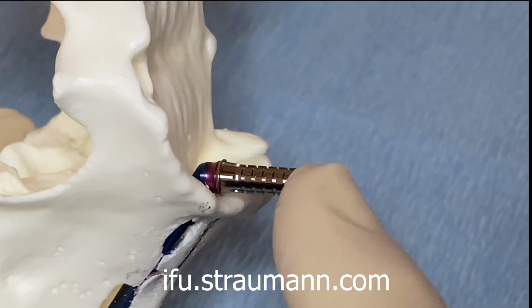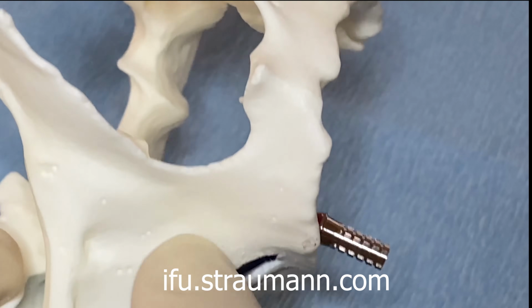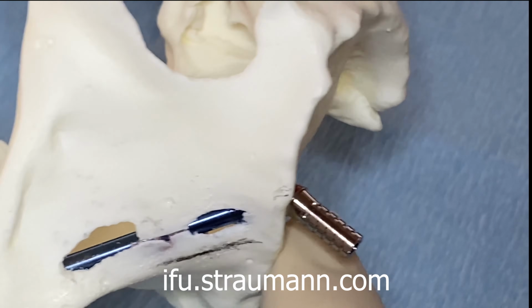So this is the Zaga 0123 lateral contour of the maxilla exercise using the round zygoma implant.